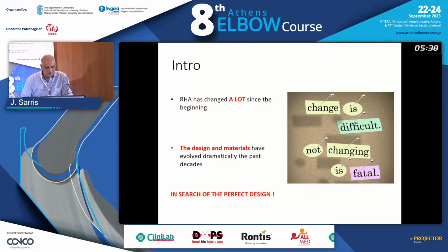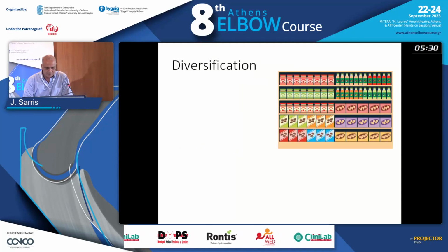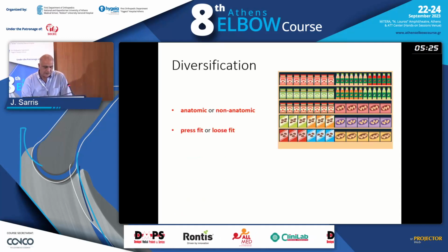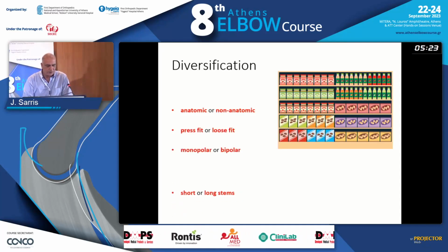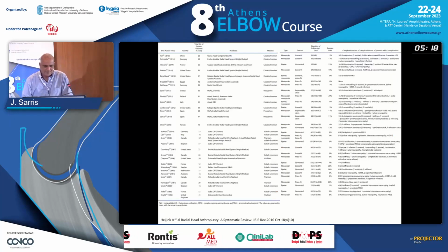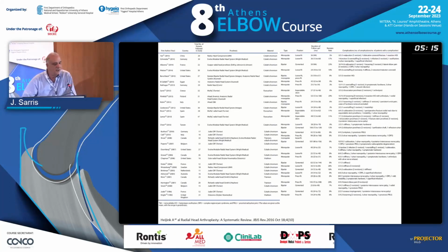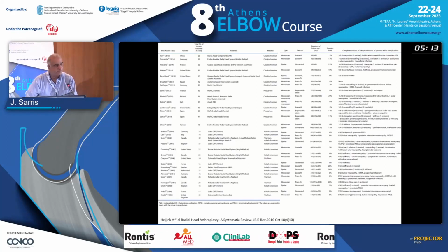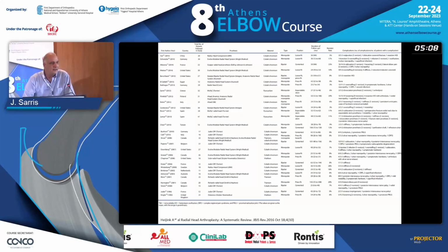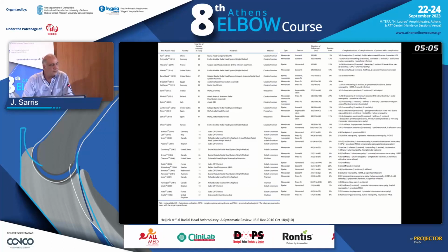Radial head arthroplasty has changed a lot since the beginning, in design and materials, but we're still in search of the perfect design. So there is a lot of diversification. We have anatomic, non-anatomic, press fit, loose fit, monopolar, bipolar, short, long stems, different materials for the radial head. This is one of the first meta-analysis papers, which include all kinds of different prostheses, different types of fixation to the radial head, and different follow-ups.